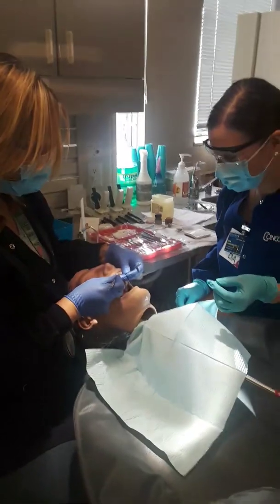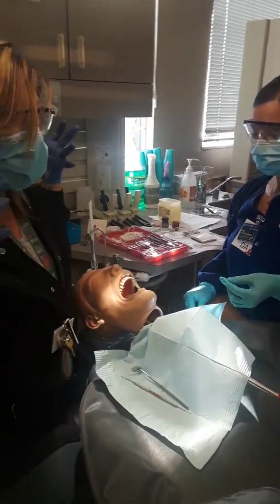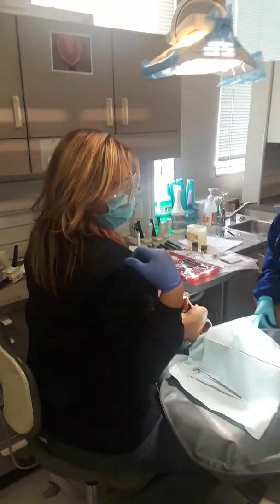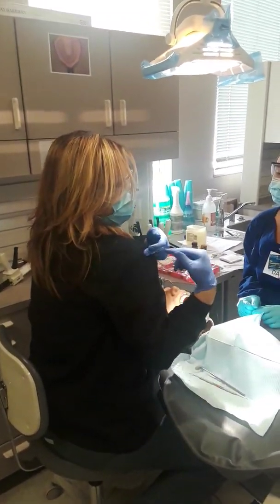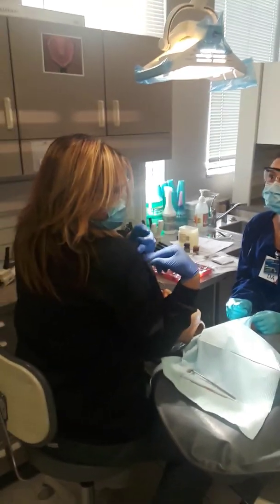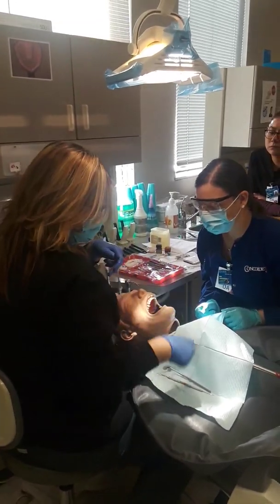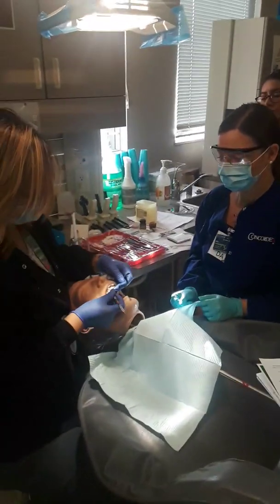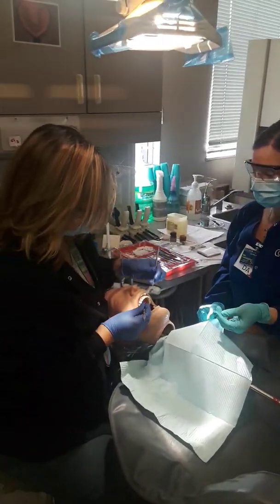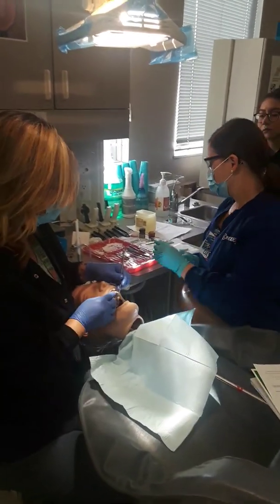Now I'm going to check my margins with my Explorer, make sure it's even. What that looks like is if I put a hat on my head, this is my margin. The edge of my margin, my crown should go up to there, and when I use my Explorer, that should be even, right there. Everything should be smooth. Margin on the facial looks good. Margin on the lingual looks good.